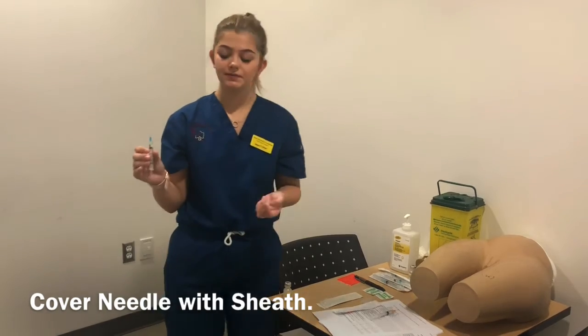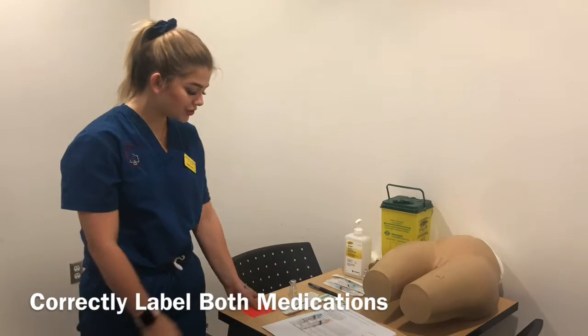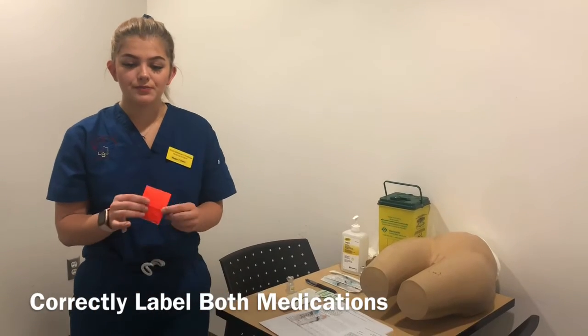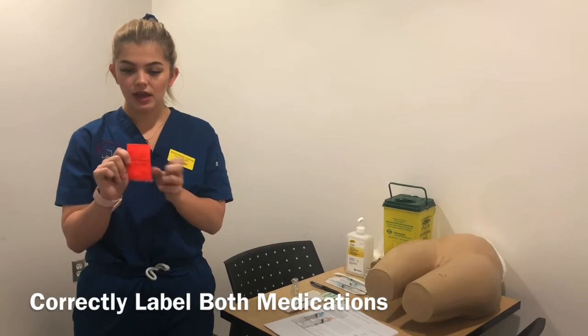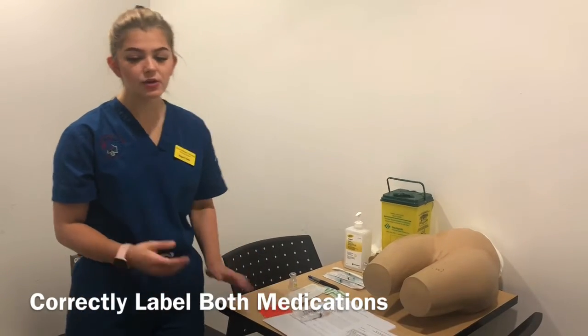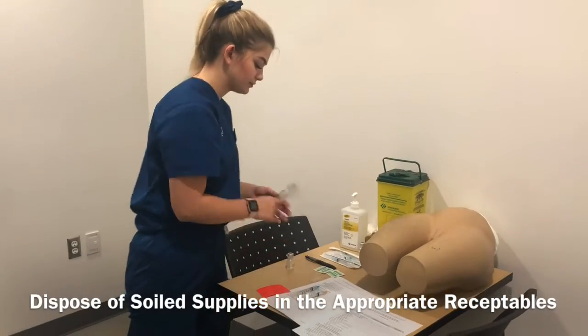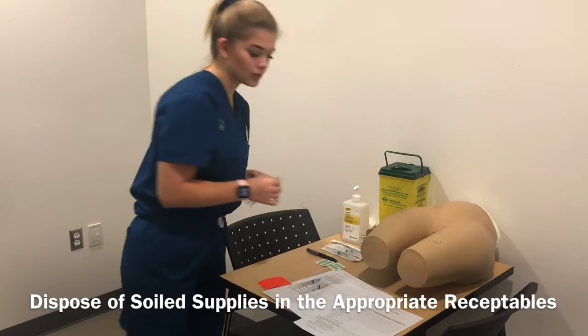administer the medication. Once you compare the medications with your MAR, you're going to write down and label your medication, and you're going to want to label it on the MAR after. And then you're going to want to dispose of any of your supplies in appropriate receptacles. So I would just throw any extra things out I don't need.